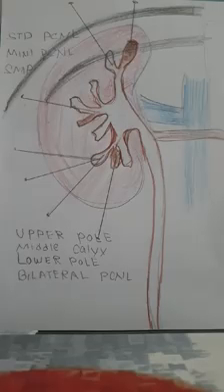Latest, we are also using supine PCNL. Before, we had been doing PCNL in the prone position, so I have also started doing supine PCNL. But in any case, I don't make up my mind beforehand. First I see the patient, and I scan, and only after that I make my decisions based on all those findings, because every kidney is different and every anatomy is different. There is no such thing as a hard and fast rule, that you have to approach this way, because all approaches are acceptable as long as you know what you are doing.